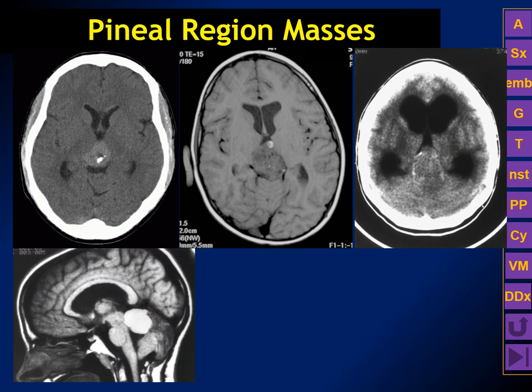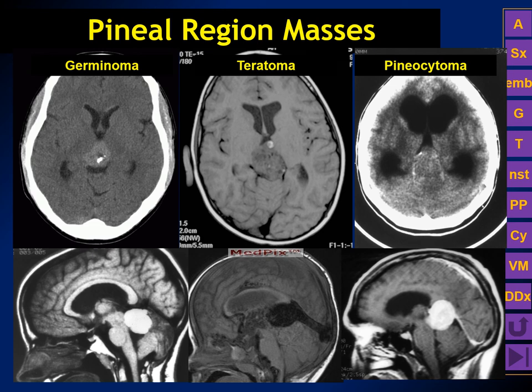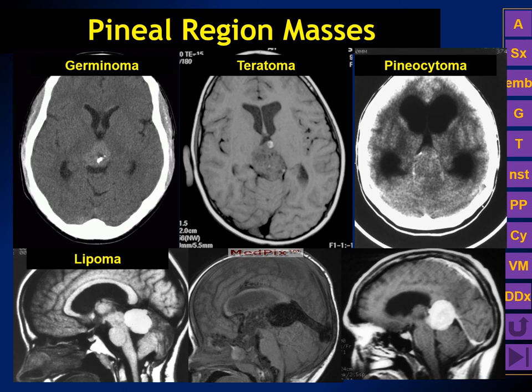Reviewing the six example images from the beginning of the talk: the first image is a germinoma showing a central calcification surrounded by a hyperattenuating mass; the lesion with the lipid is a teratoma; dispersed or exploded calcifications are seen in pineal parenchymal tumors; the lipoma is hyperintense before contrast is given; vein of Galen malformations show up as a prominent flow void; and the final example is a meningioma. Thank you very much for your attention.